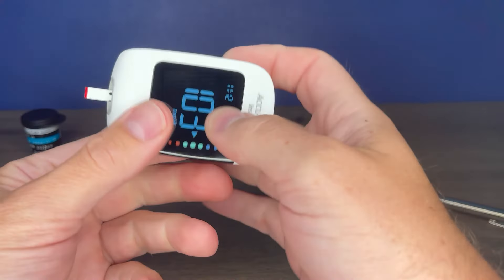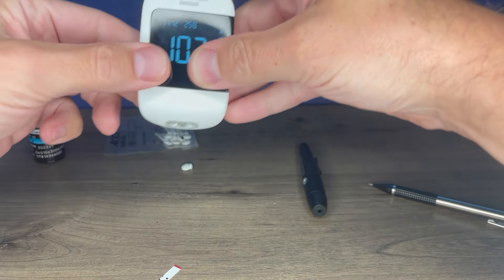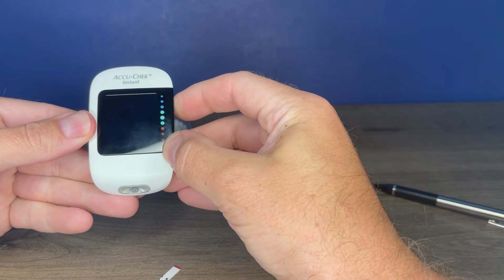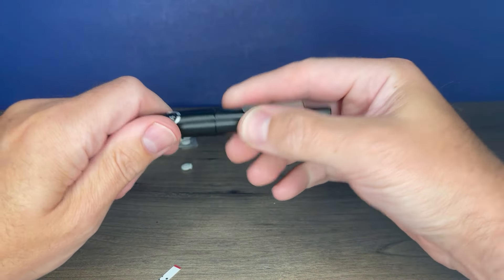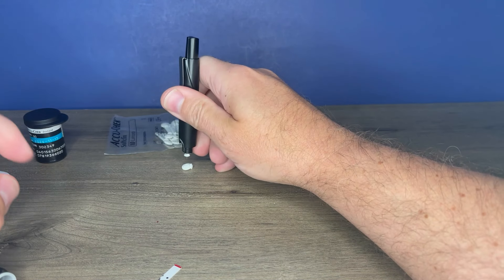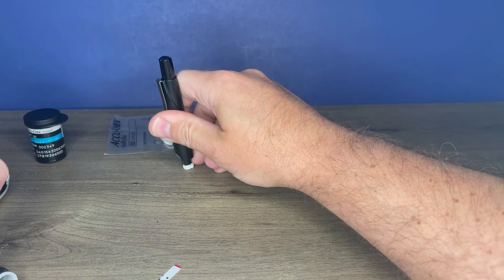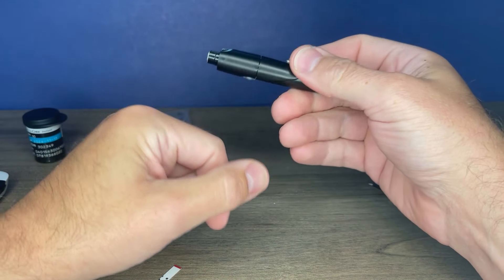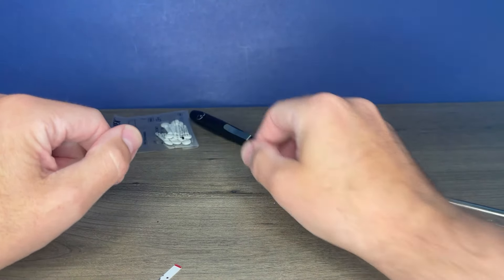You can use the test strip eject button to eject the strip. The meter will power off, or you can press and hold the top button to power it off. Then remove your lancet from the lancet device — pull off the top. I like to jab it into the piece of plastic that came off the top so it can't accidentally poke someone. Move the sleeve forward and that ejects the lancet. Replace the cap and it's ready for next time.